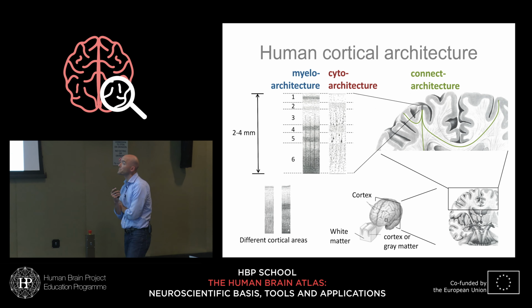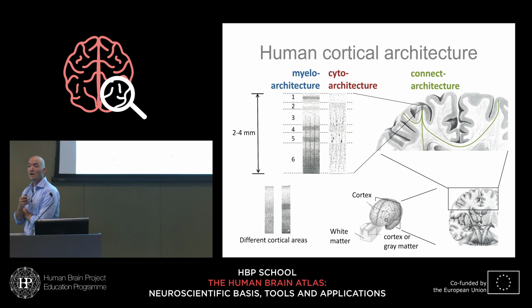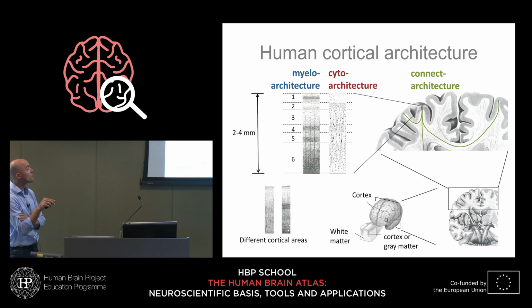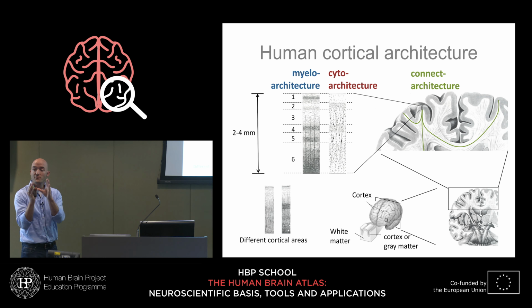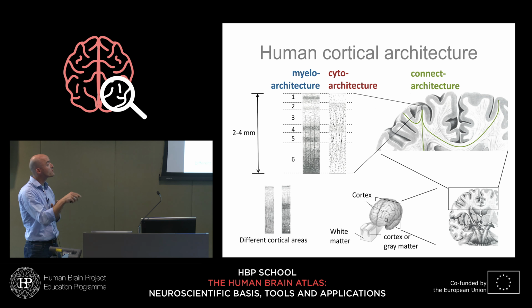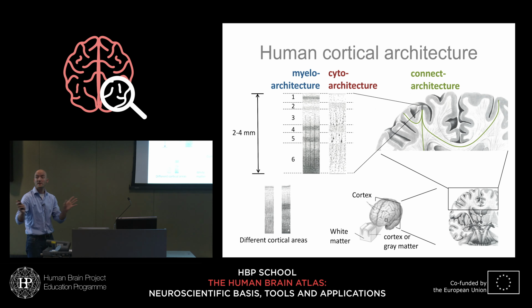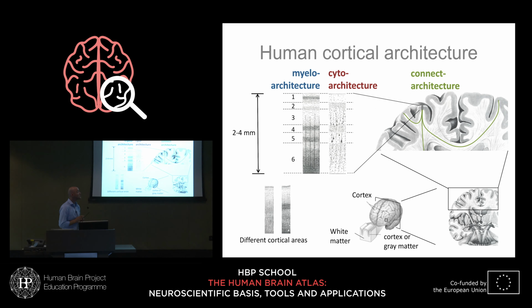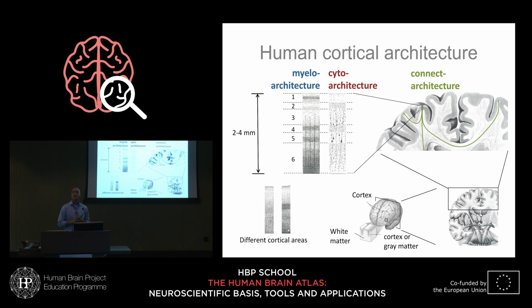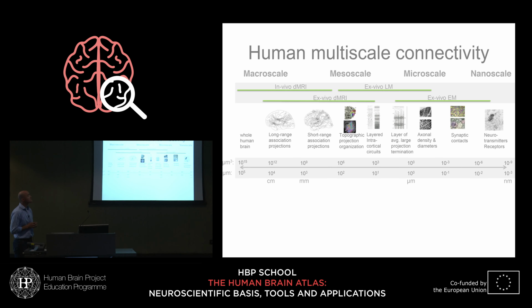That also brings the challenge of trying to image all of the architecture of the human neocortex. We could zoom in with light microscopes all the way to see single cells, but that usually confines our field of view to looking at this one column of cortex, whereas each of these pyramidal cells could have axons that travel all the way to the other side of the cortex, and they could also ramify along the way and have very large axonal ramifications that span many tens of centimeters or cubic centimeters. So that puts up the challenge that we have if we're trying to image this.